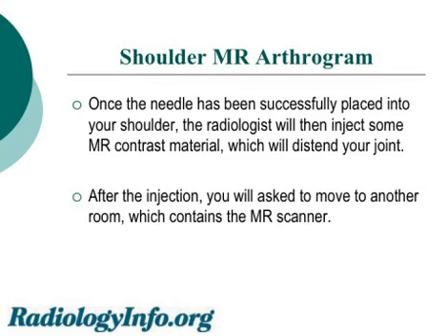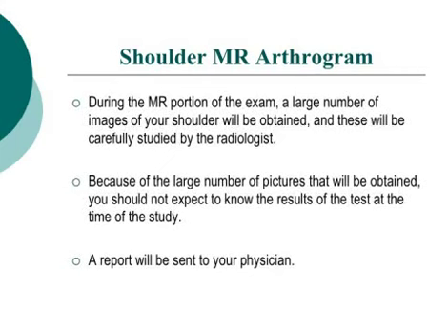After the injection procedure, you will be asked to move to another room which contains the MR scanner. During the MR portion of the study, a large number of images of your shoulder will be obtained, and these will be carefully studied by the radiologist. Because of the large number of pictures that are obtained, you should not expect to know the results of the test at the time of the study. However, a report will be sent to your referring physician.